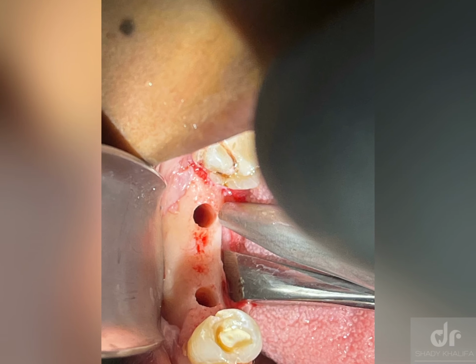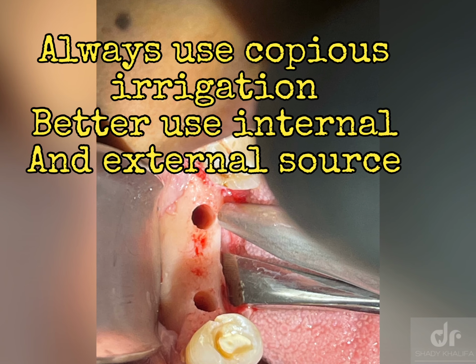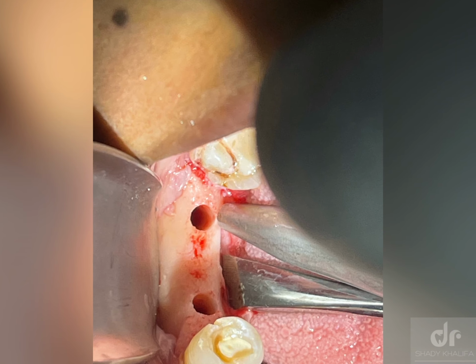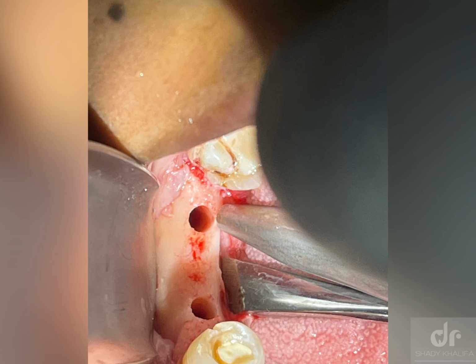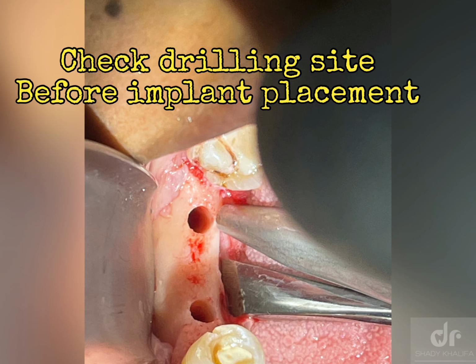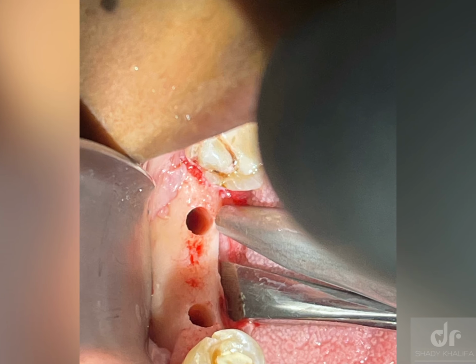This is the photograph taken after the final drill, and we are ready now to put the implants. We can see here also the buccal and lingual plate. We estimate also the direction. Actually, in this picture, I tried to take a photograph that will show it well, because it's different from side to side.